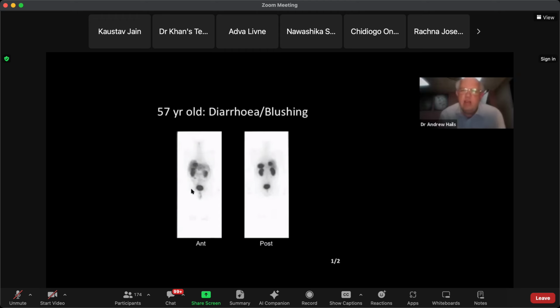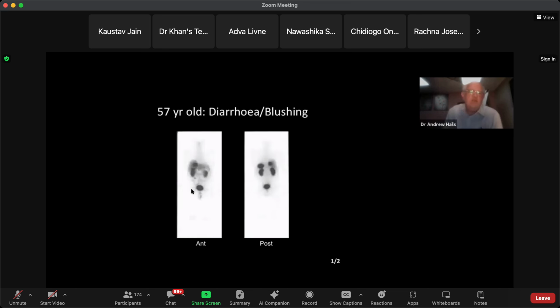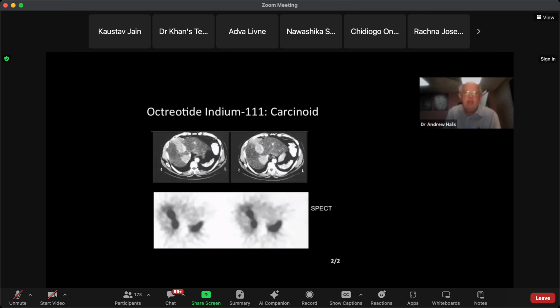No, that was thought to be a carcinoid tumour. And as I understand things, if you've got symptoms, you're likely to have got metastases from it. And there were hepatic metastases. Well, this is the same thing, so I should have shown you this really. It's blown up, it's enlarged, and as you correctly identified, there's a carcinoid tumour, and there are some abnormal areas in the liver. And this is obviously a SPECT CT, and the SPECT images show the increased uptake in the liver.